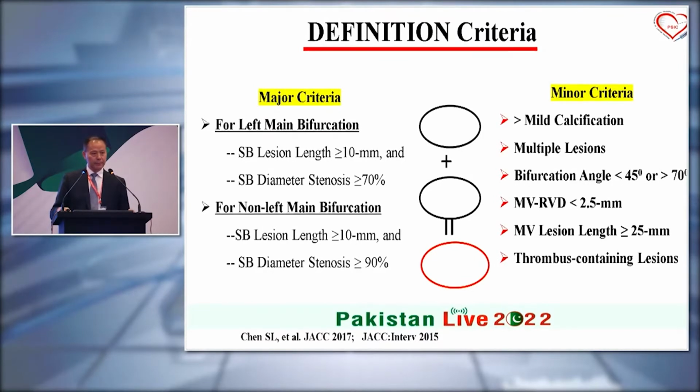So for these two kinds of true coronary bifurcation lesion, actually, the two-stent technique is frequently required. From randomized studies, let's go back a few years ago to the EXCEL trial, comparing PCI and CABG for left main disease, but not only for left main bifurcation lesion. After 5 years of follow-up, the final result favored the one-stent strategy compared to the two-stent technique.